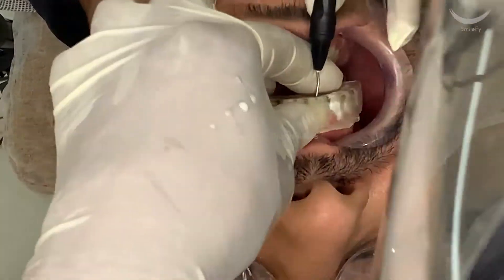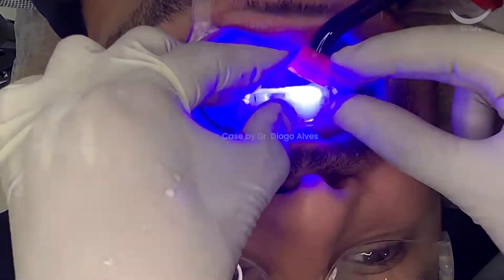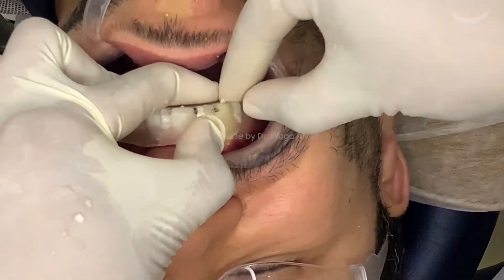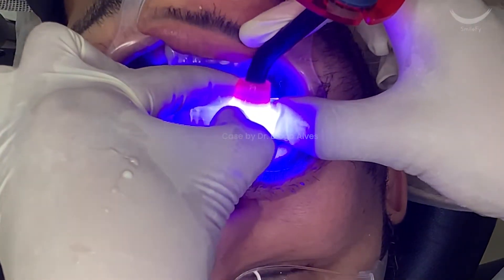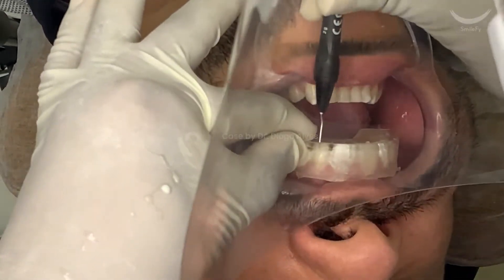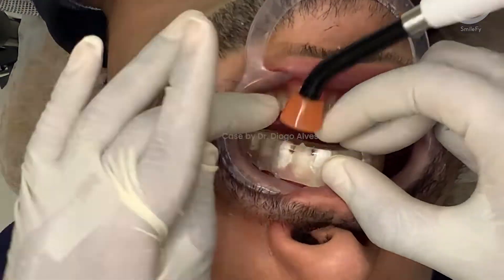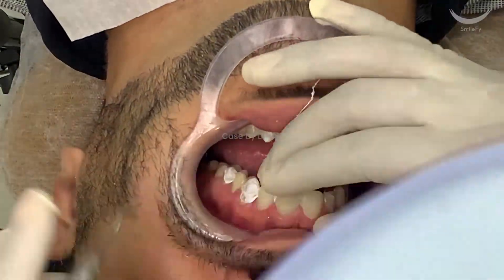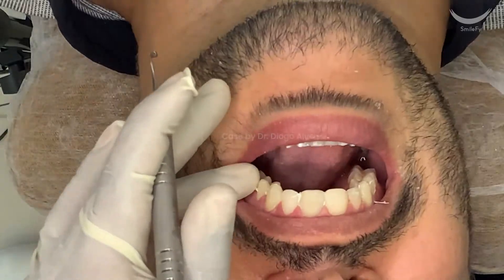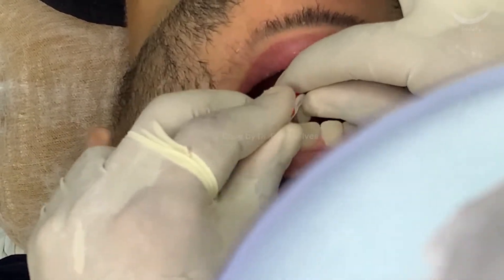The transparent index was then placed into the patient's mouth and held firmly while the flowable composite resin was injected through the excess hole of the incisal edge, filling the entire surface. The same step was performed on the other teeth. Each composite restoration was light cured through the clear resin matrix for 20 seconds on the facial and 20 seconds on the occlusal/lingual surface. The transparent index was then taken out, excess flash was removed with a blade instrument, and Teflon tape was removed while a final metal finishing strip was used to create space in the interproximal area.